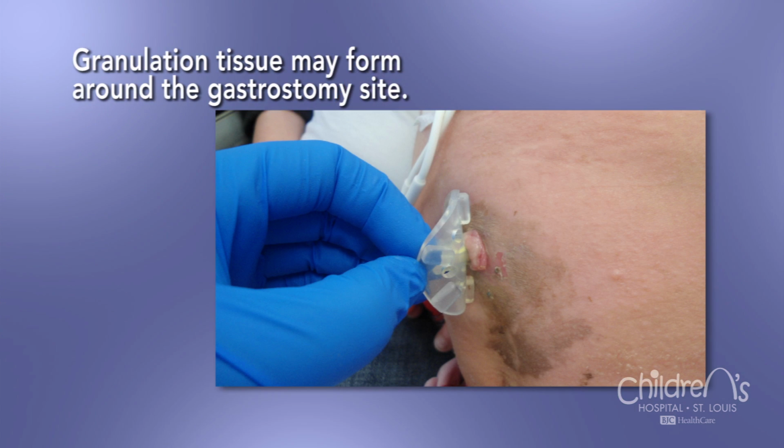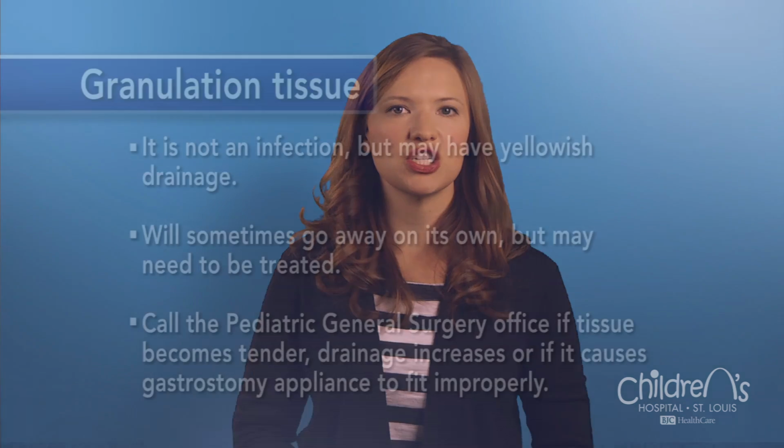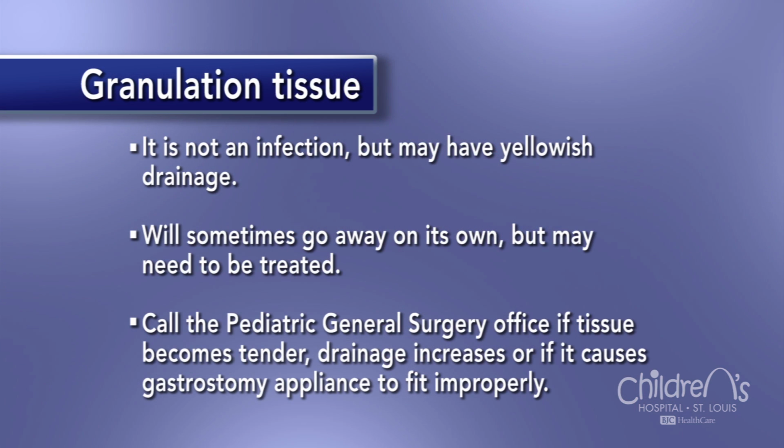Children often develop granulation tissue around the gastrostomy site. This is extra tissue that grows around the gastrostomy. You cannot always prevent granulation tissue from forming. The tissue contains many capillaries, or small blood vessels, that make it look red or pink. It looks just like the gums inside of your mouth. Do not worry if you see tiny spots of blood if the tissue becomes irritated, because this is normal. Granulation tissue is not an infection, but can sometimes have yellow drainage.